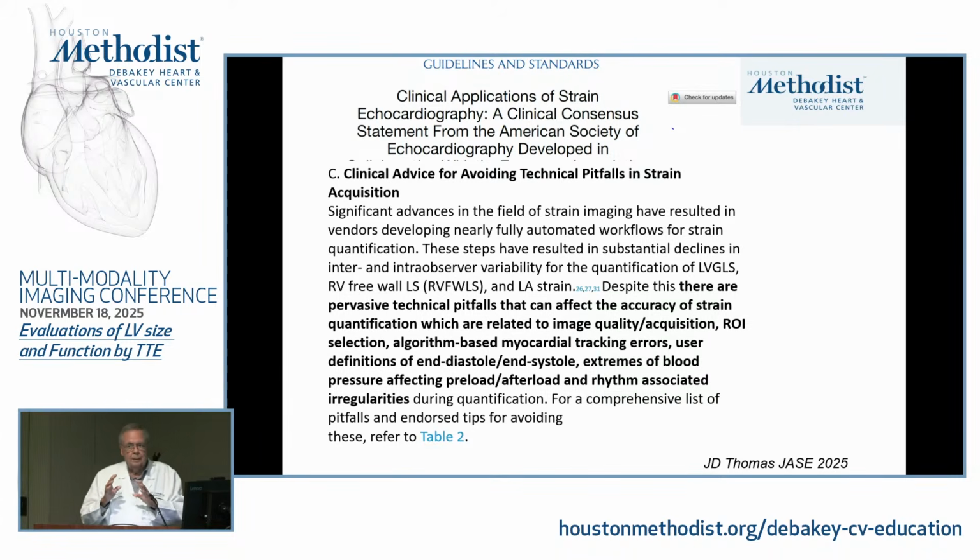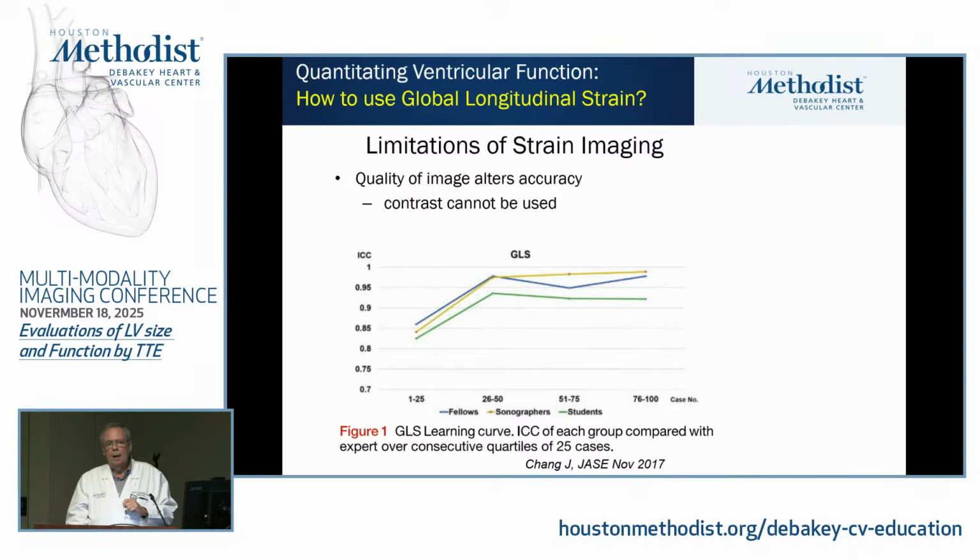One of the things that they will discuss in the article is, depending on how the tracking is done, you could be tracking epicardial or subepicardial, you could be tracking more mid-wall, or you could be tracking endocardium. If you do epicardial, values are going to be much lower. If you do endocardial, values are going to be the highest, and mid-wall would be somewhere in between. So paying attention that your tracking is going more through the mid-wall, because that's the one that we're trying to do the most, is important.